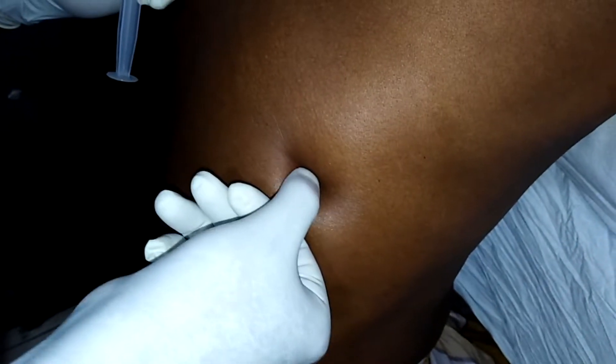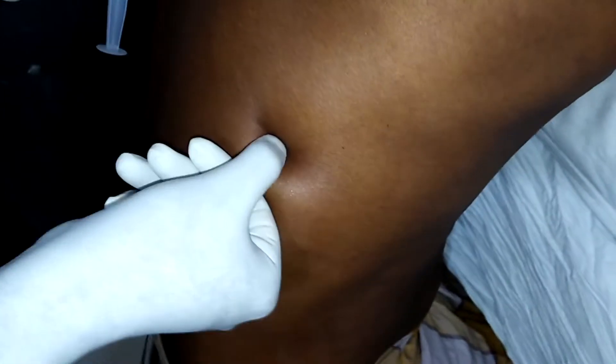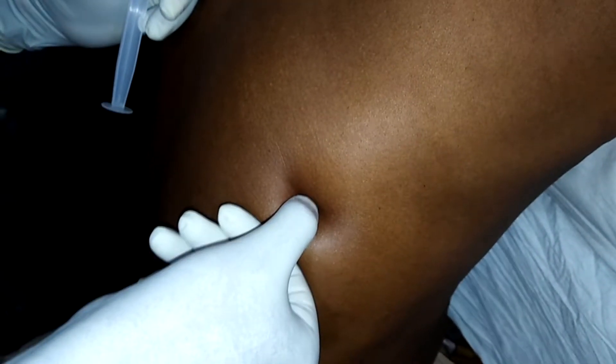The procedure is performed to remove a sample of tissue for analysis.